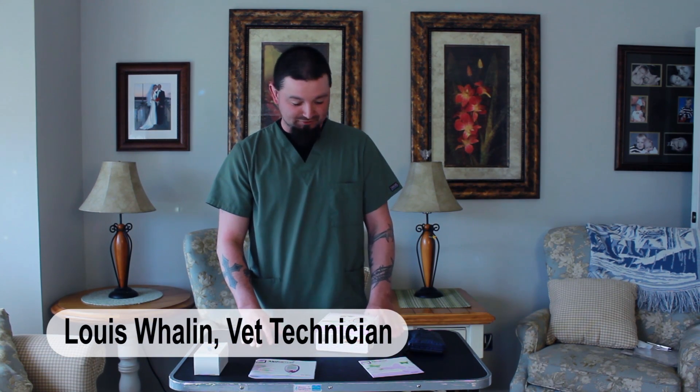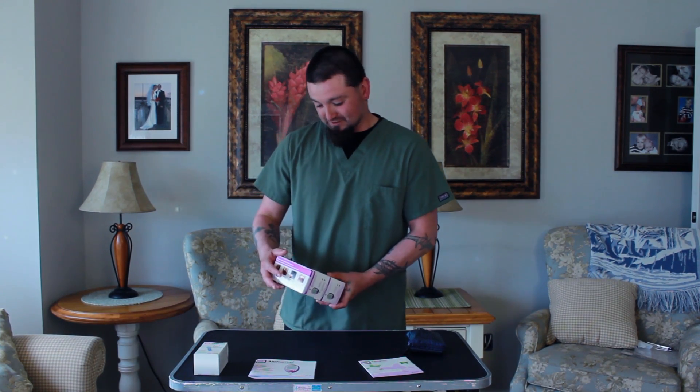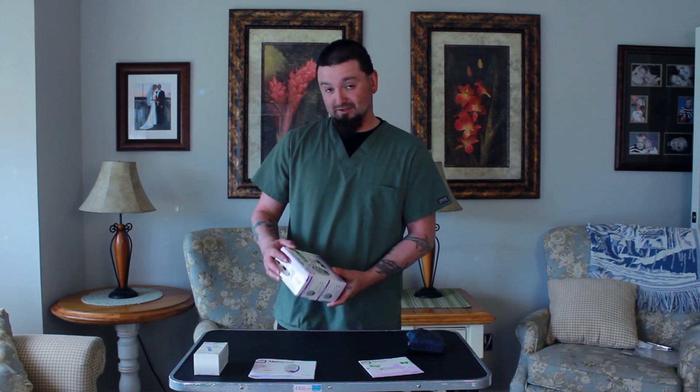My name is Louis. I'm a technician over at House Paws Mobile Veterinary Service and I want to show you how to use your in-home glucose monitoring kit from AlphaTrack. It's important to use a kit that's specific towards animals, not humans. Their values are a little bit different and can cause some serious problems.